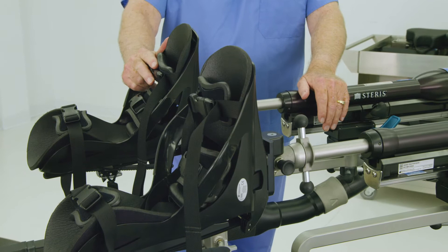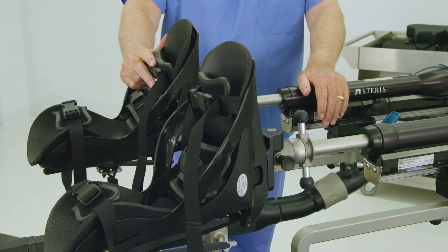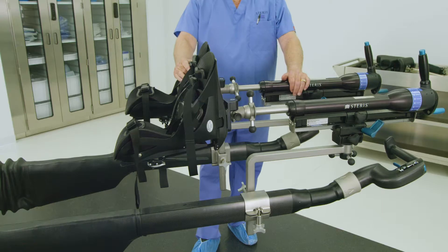Orthopedic procedures requiring skeletal traction may not require traction boots. Skip this step if a skeletal traction bow or bow block is used.